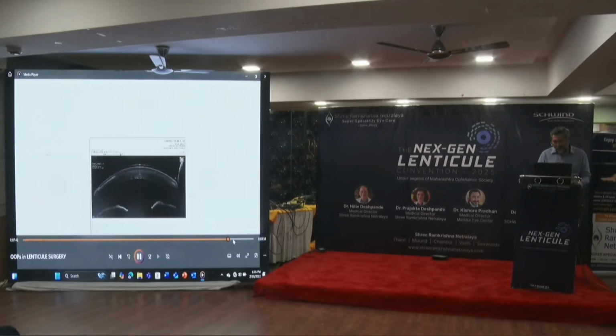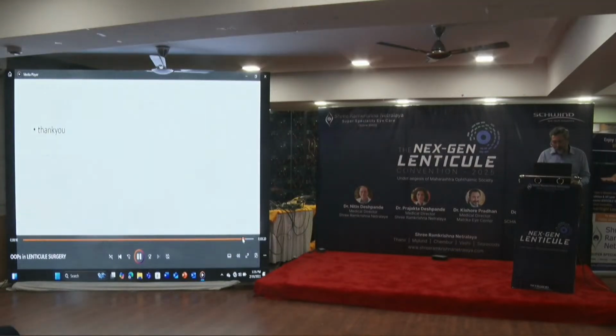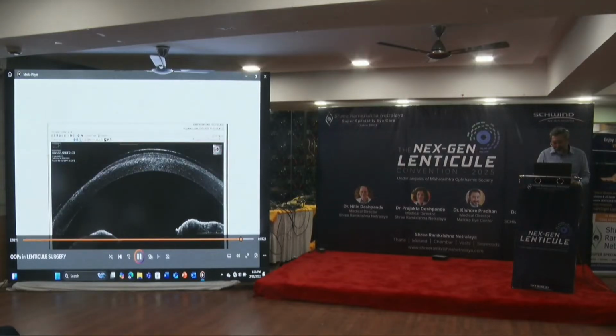You see a lot of fluid over there, inflammation, DM folds, and these can give you so much trouble. What happened was that the cap started melting. You see, it started melting from one side because the nutrition to the cap was obstructed by the fibroblastic membrane.